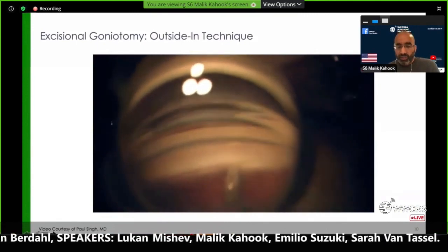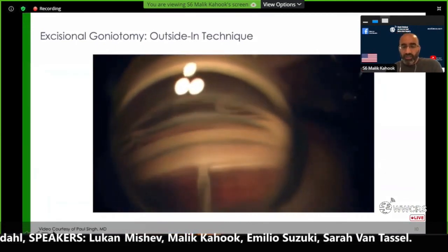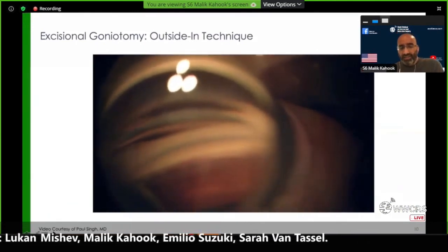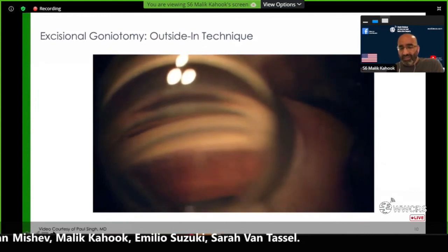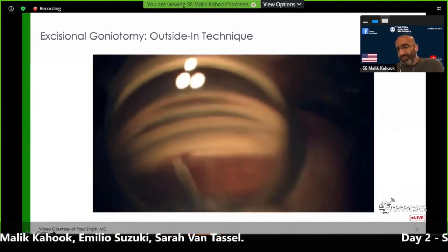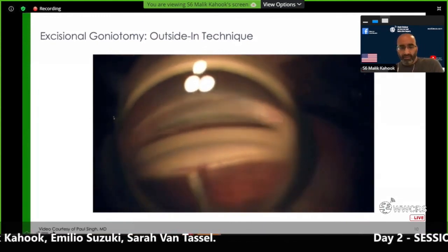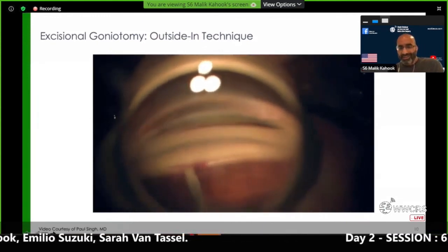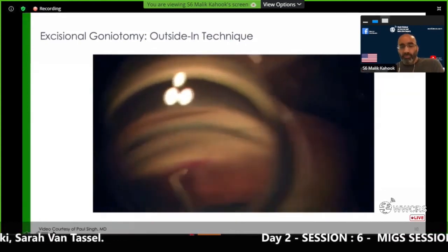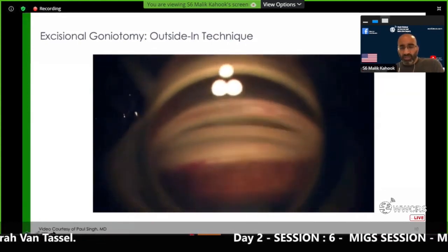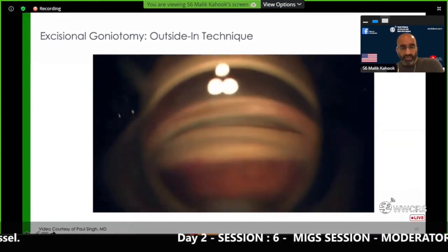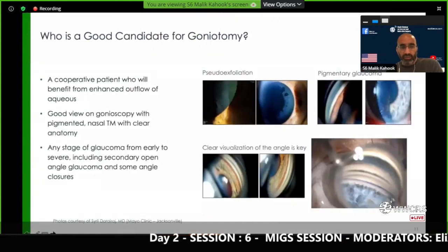This is Paul Singh doing the procedure from right to left and then switching from left to right, just to give you an idea of how long this takes. The skill set really is in the gonioscopy part—recognizing the anatomy—but much of the motion is something we're familiar with as anterior segment surgeons.